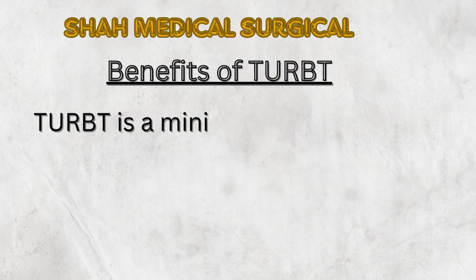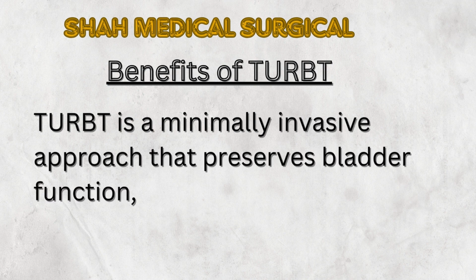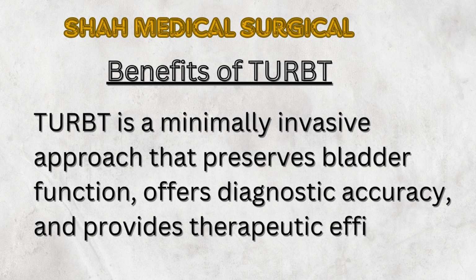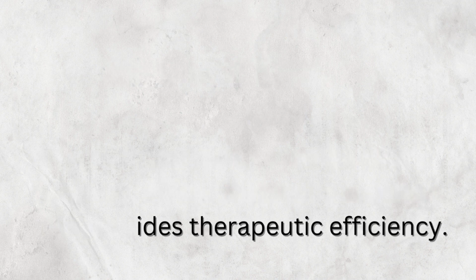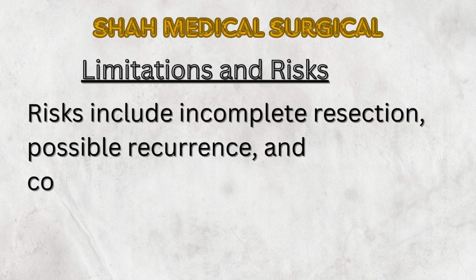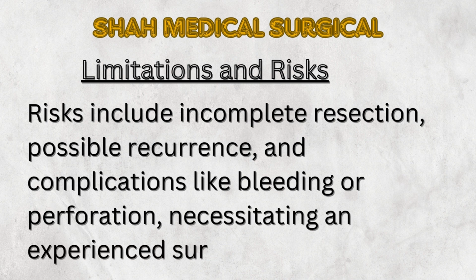Benefits of TURBT. TURBT is a minimally invasive approach that preserves bladder function, offers diagnostic accuracy, and provides therapeutic efficiency. Limitations and risks. Risks include incomplete resection, possible recurrence, and complications like bleeding or perforation, necessitating an experienced surgeon.